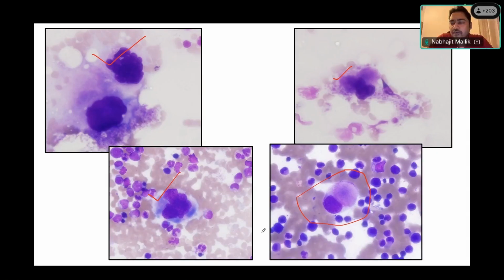Wonderful, right? And the first thing you would need to confirm is the cellularity. We can take an estimate of the cellularity in the bone marrow aspirate, but it has always got to be confirmed in the bone marrow biopsy. And the second thing, you also said very rightly, is where the cells are placed. Are they placed in their normal location or not? So these are the two things that you definitely want to see. Anything else? Fibrosis can be checked after reticulin stain. Yes, fibrosis also.